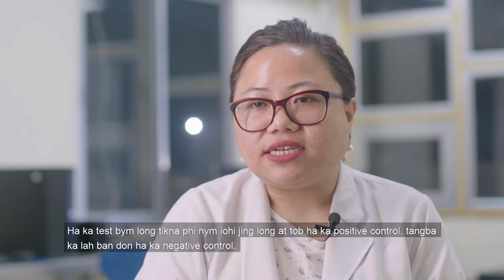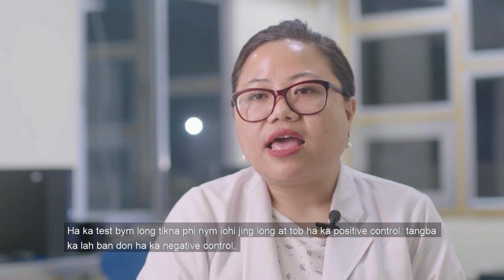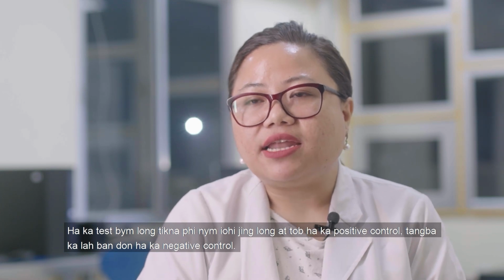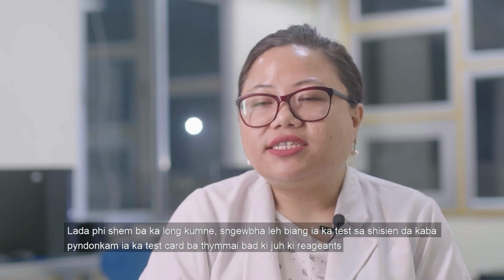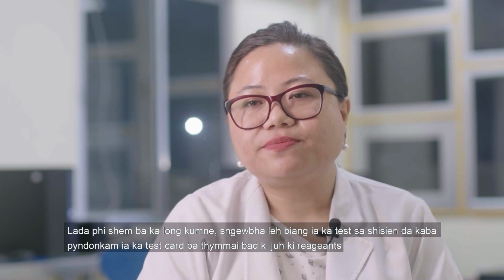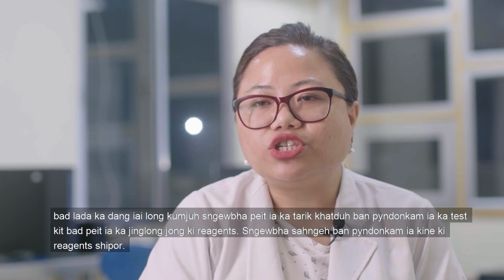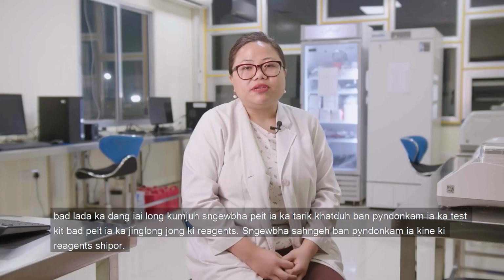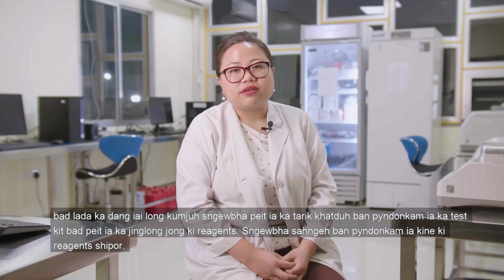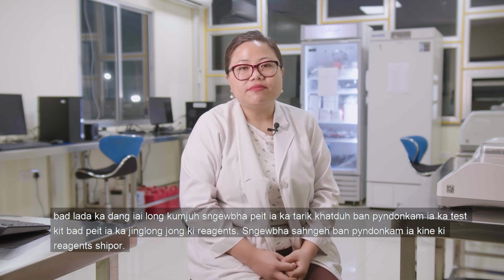In an invalid test, there will be no clumping in the positive control and there might be clumping in the negative control. If an invalid test is seen, please repeat the test once again using a new test card, using the same reagents. And if it continues to show an invalid test, please check the expiry date of your kit box and check the integrity of the reagents. In the meantime, please stop using the reagent.